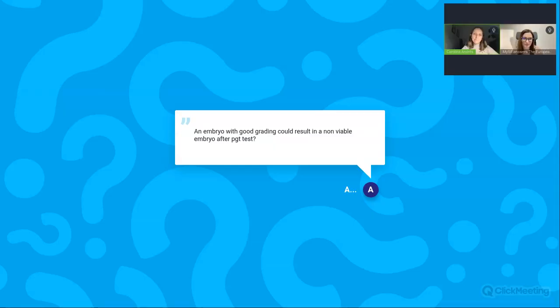Okay, sure. And how about this question? Could an embryo with good grading result in a non-viable embryo after the PGT test? Exactly. Embryo grading is not related to the genetic content of the embryo. I always say this to our patients. A good quality embryo will assure us that the embryo is going to be viable during the PGT procedure, the freezing and the thawing, but it's not related to the genetic content. So we can see beautiful embryos that are aneuploid and that we have to discard.